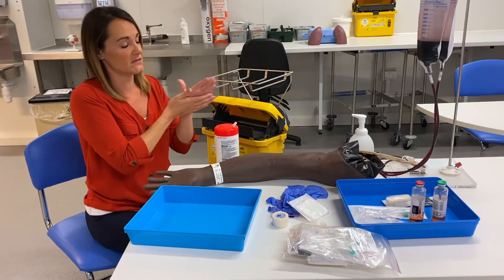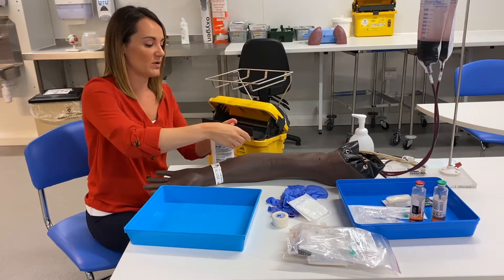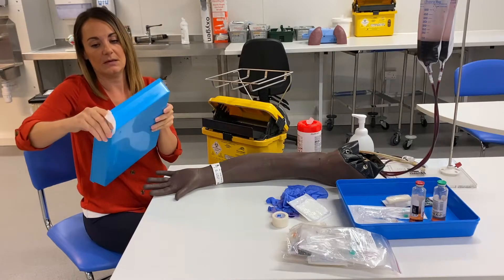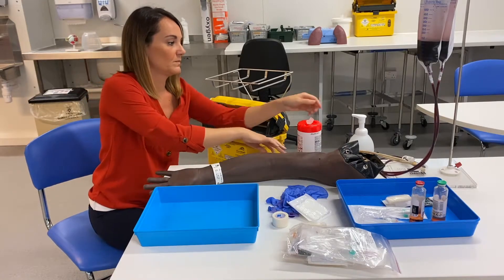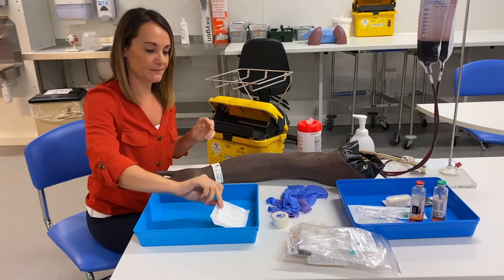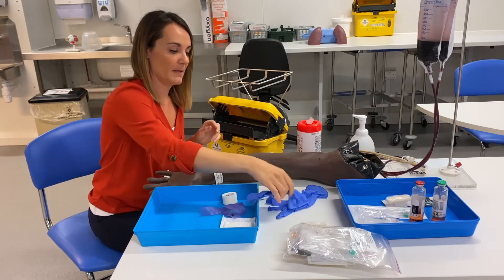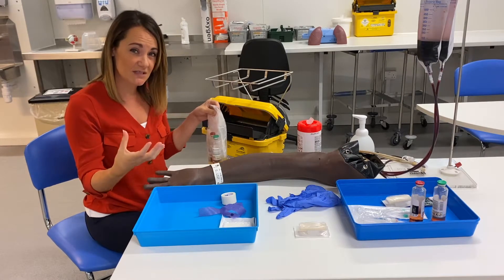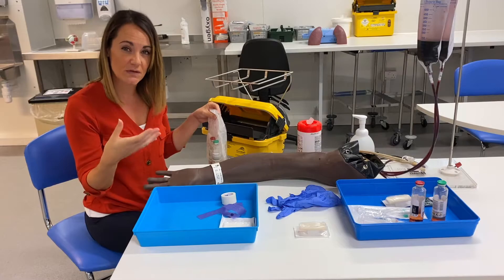It's really important to wash your hands first and put an apron on as well. Get your tray and give it a very good clean, working your way inside and out. Take your sharps bin with you as well, along with some gauze, a tourniquet, some tape, and everything you need in the pack. When you go to your patient, it's really important to remember to identify your patient in the correct way, gain their consent, check their wristband — all those usual things that we've learned in phlebotomy.